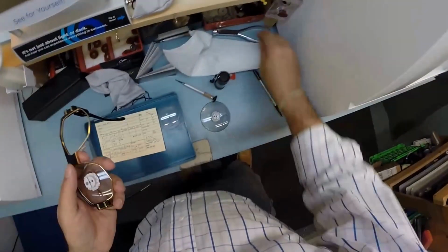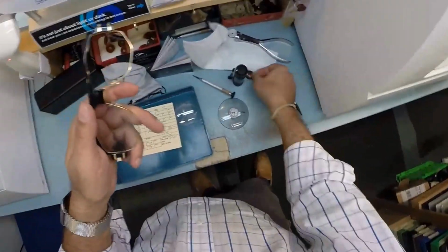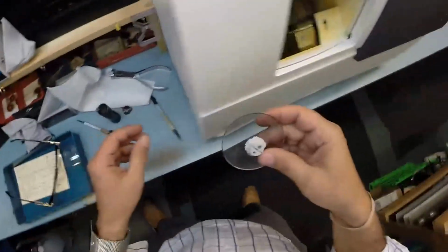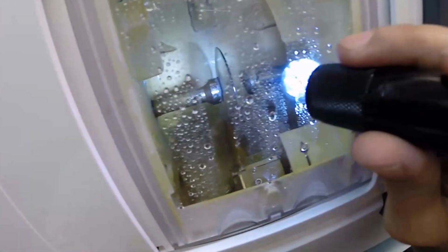Alright, so that's good. Let's go ahead and take this block off and we can go ahead and get started. Pull that sticker off, we don't need that. Let's go ahead and get started cutting the left lens. Flip that over to L. Put the lens into the chuck, the Charles, the Chucky baby. Hit the start button, the door closes just like before.